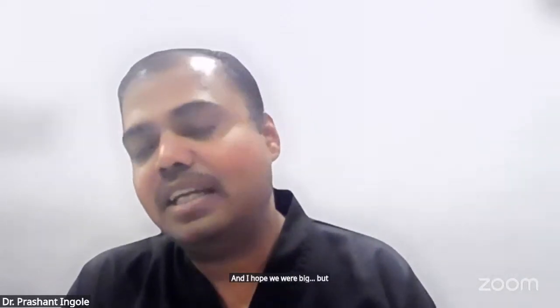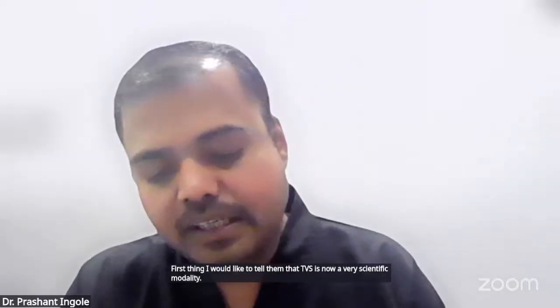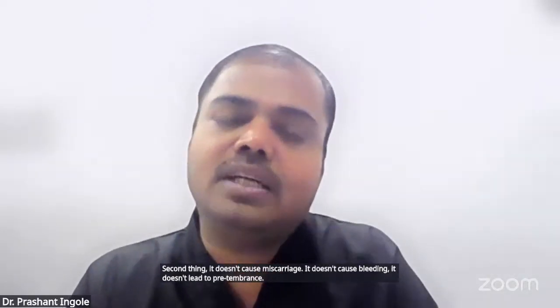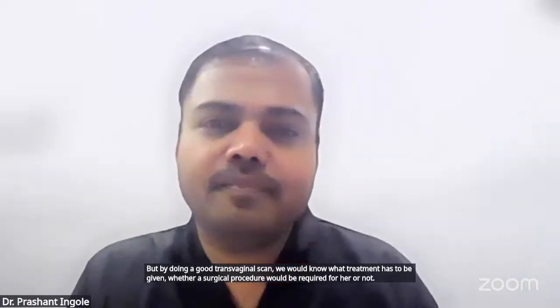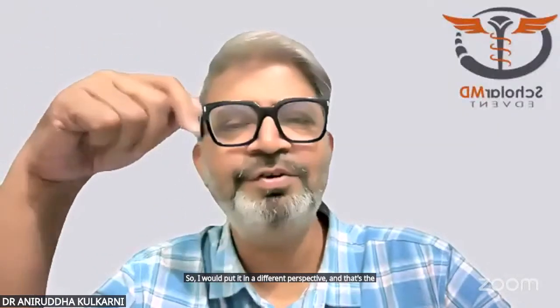Before sending such patients, the first thing I would like to tell them is that TVS is now a very scientific modality. Second, it doesn't cause miscarriage, it doesn't cause bleeding, it doesn't lead to preterm births. But by doing a good transvaginal scan, we would know what treatment has to be given, whether a surgical procedure would be required for her or not. So I would put it in a different perspective, and that's the way I usually put it during most of my clinical talks.